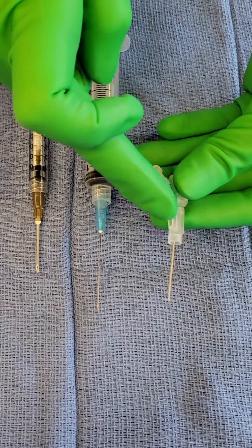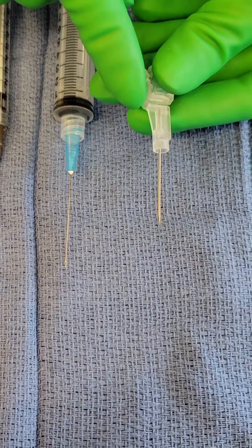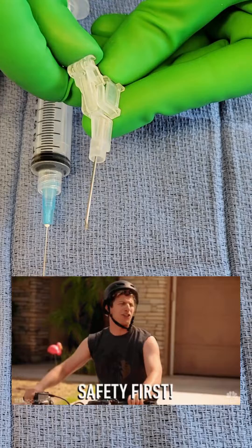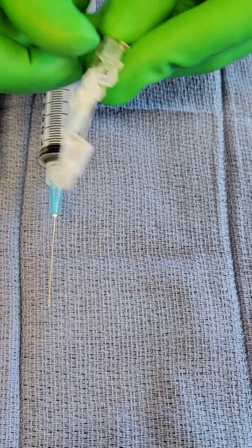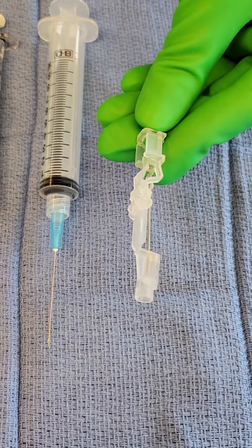Notice this needle looks a little bit different from these needles here. That's because this is called a safety glide needle. It has a safety function on it so that when you're done injecting, you can push this forward and the tip of your needle is protected to avoid needle sticks.